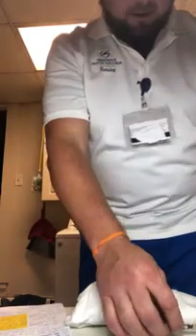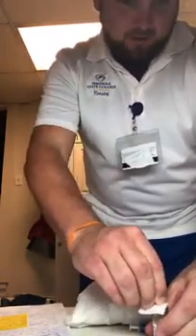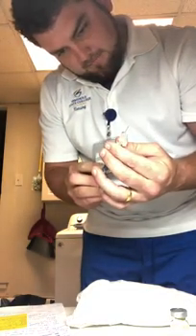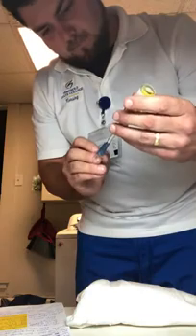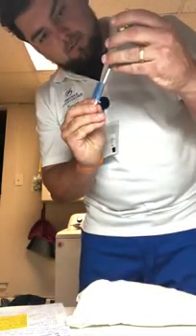So I got my alcohol swab. We're going to clean the top of that real good. I'm going to remove that. I'm going to draw back 0.5 with the air, and we're going to stick it in, inject the air in. I'm going to invert it, and we're going to be withdrawing.